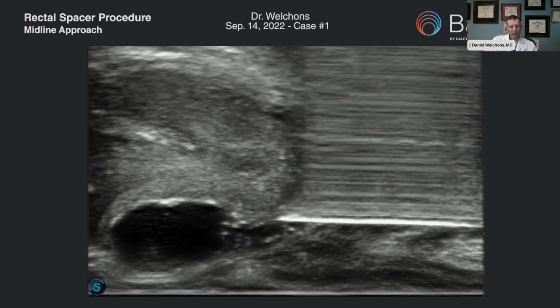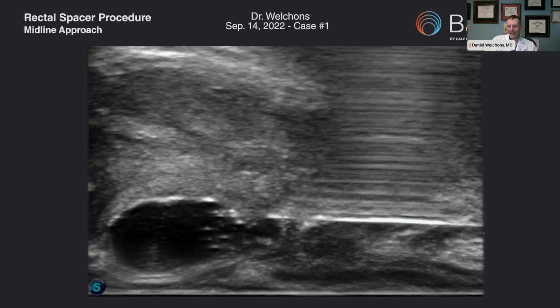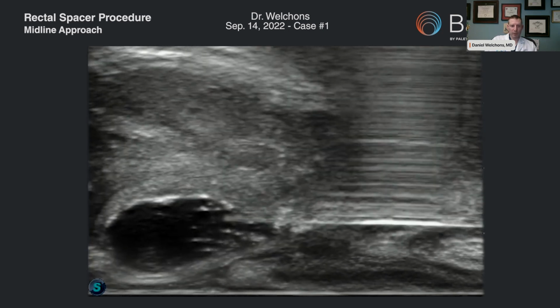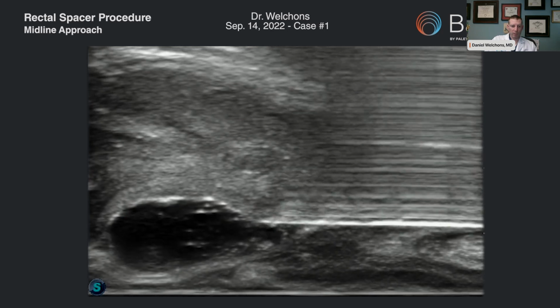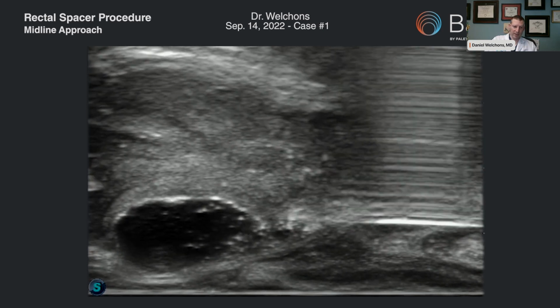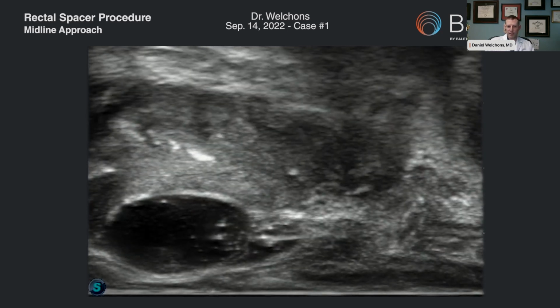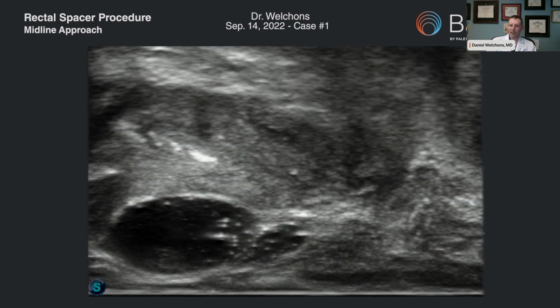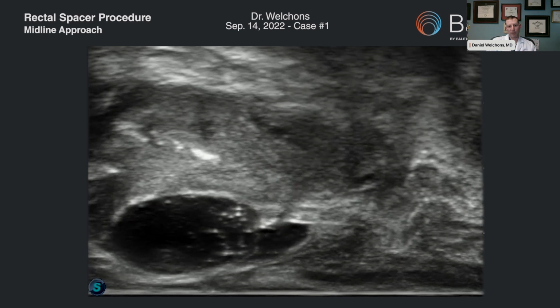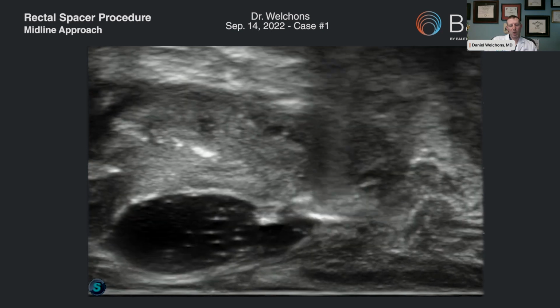You can see the gel is being injected. This is the area where there's a little bit of fibrosis. It's not opening up quite as nicely as it did at the base of the prostate, but it's still opening up. It's just taking a little bit of time to move the needle. I put some downward pressure on the needle from the transperineal space, and that causes the needle to move anteriorly, which can free up some of the fibrosis and help make a space. So as you move upwards and then move backwards, the Barrigel product fills that gap and leads to a really nice result. So there is some maneuvering of the needle.